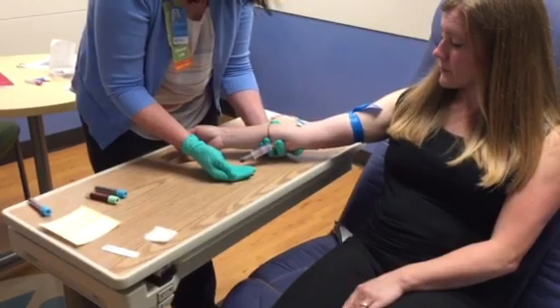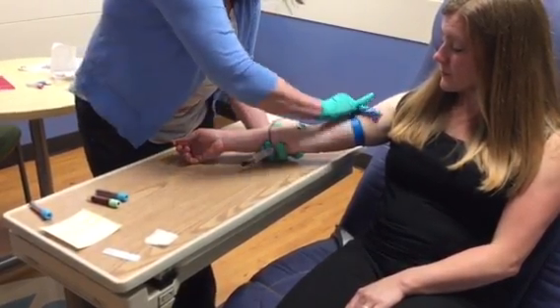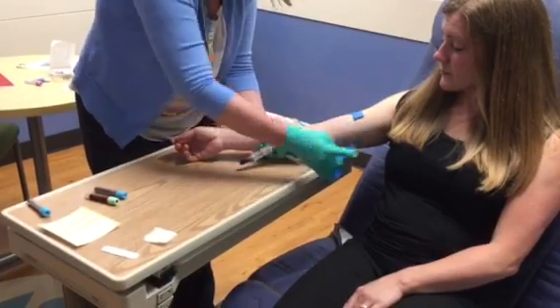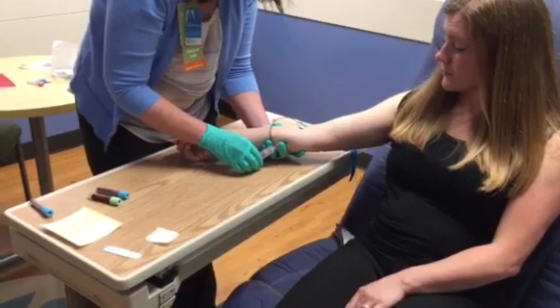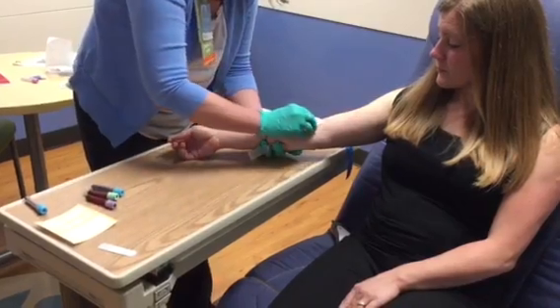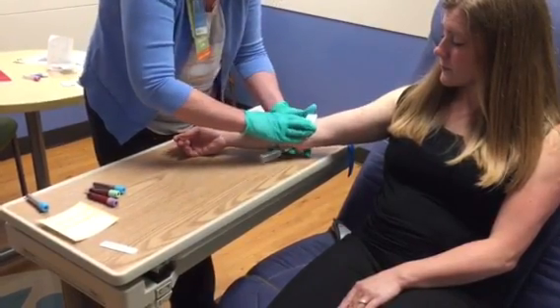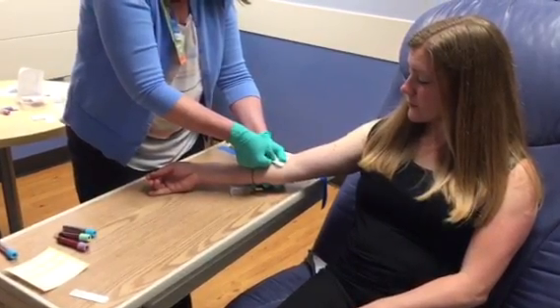Following your proper order of draw, ensuring that you cover the entire hole of the needle with the gauze before you activate the push-button retraction.